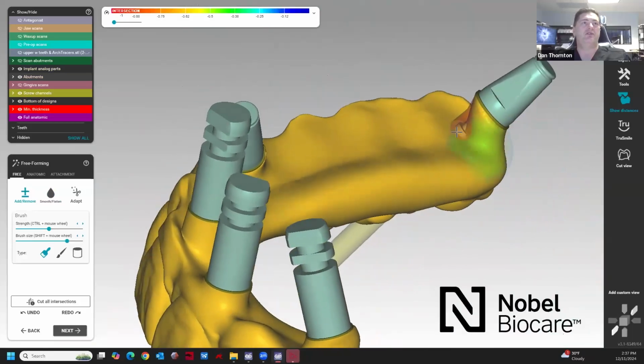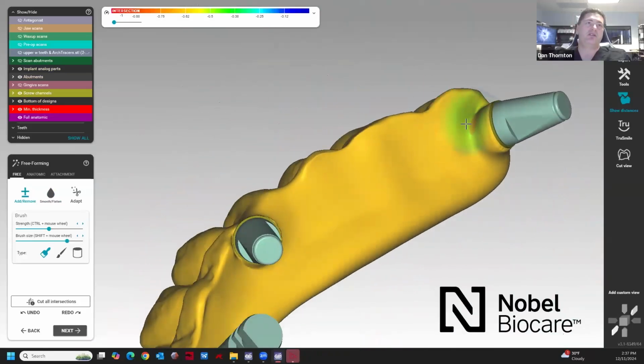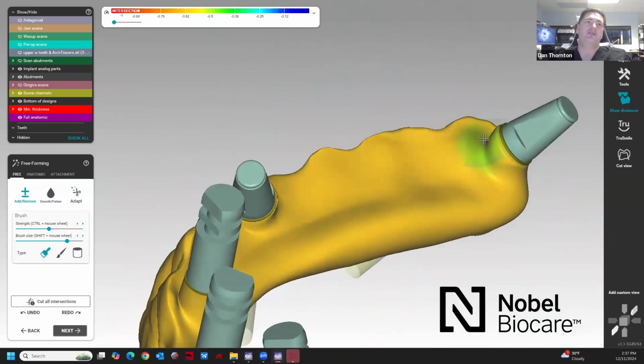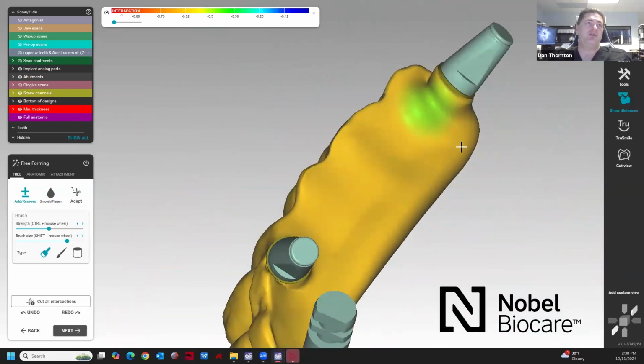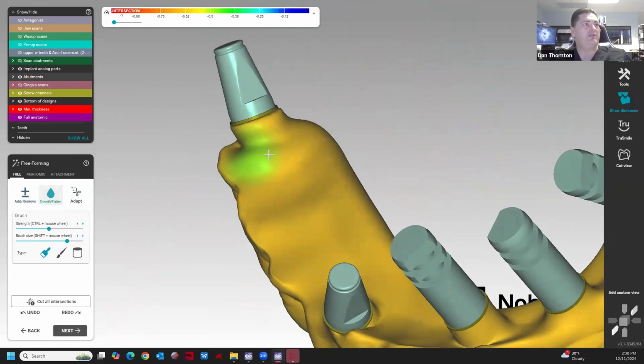Especially if I know there's teeth, like space is going to be there from the teeth. It's good. A lot of times if it's a toothless area, then we don't know if they created that pocket for the tooth. So then I would just adapt it to the tissue.